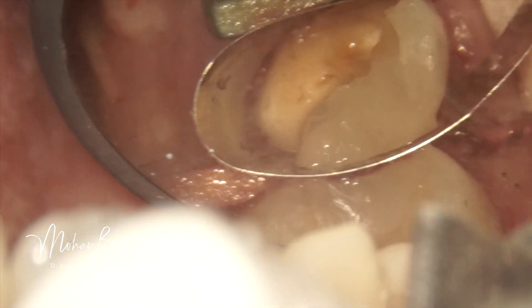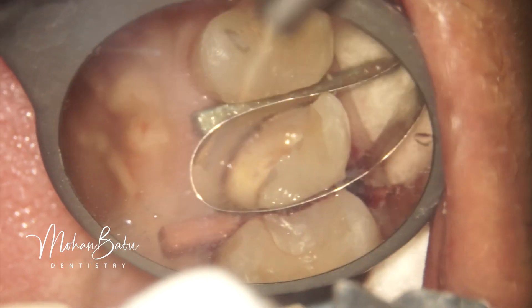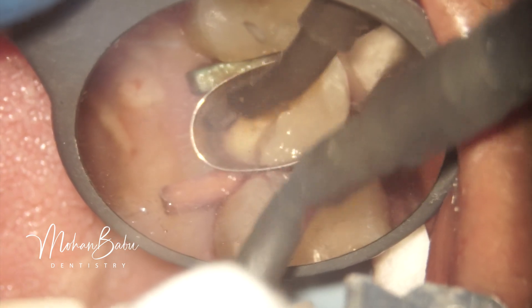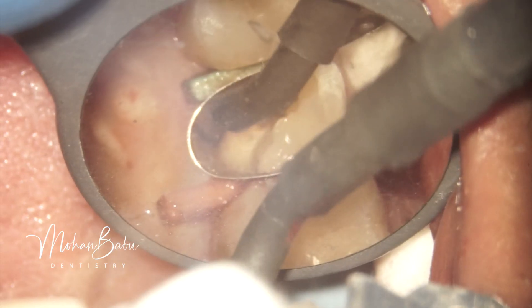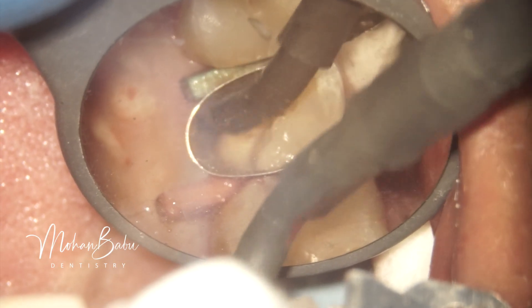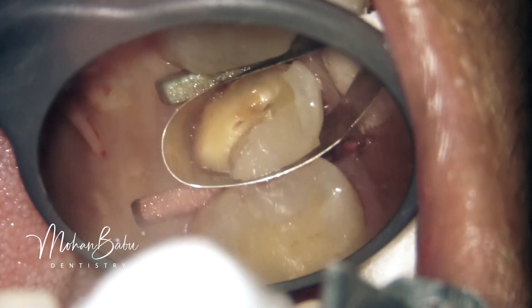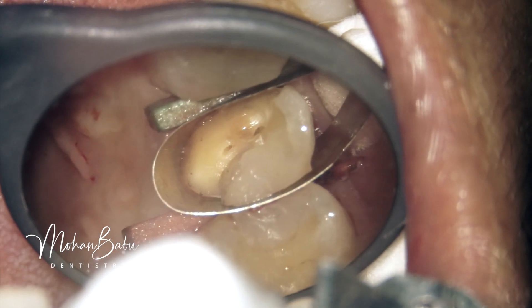So what we planned was to use electrocautery between the matrix and the tooth surface, so that we could get a decent amount of isolation without any fluid seepage, allowing us to do a pre-endo buildup with GIC material. We successfully achieved isolation without any fluid seepage.